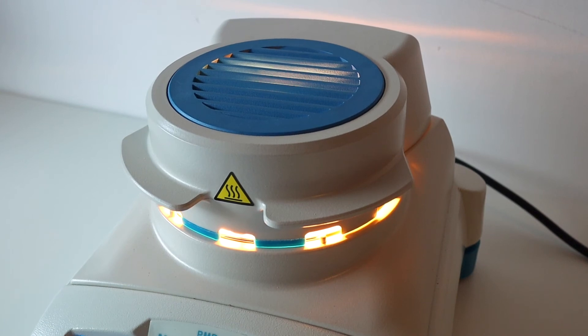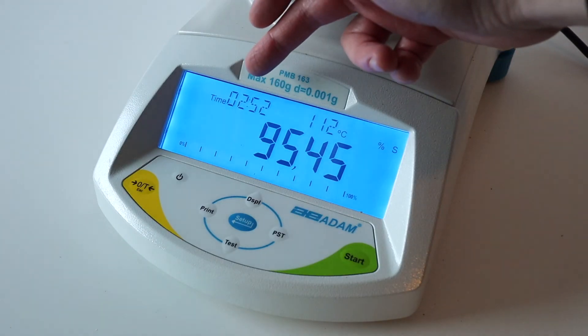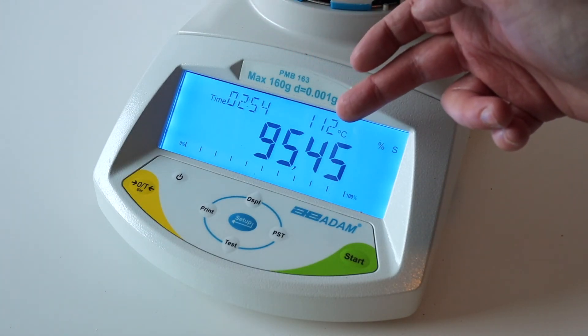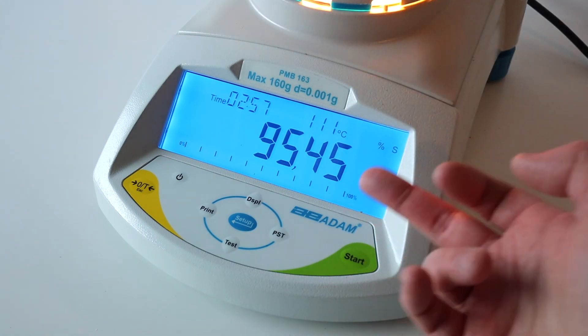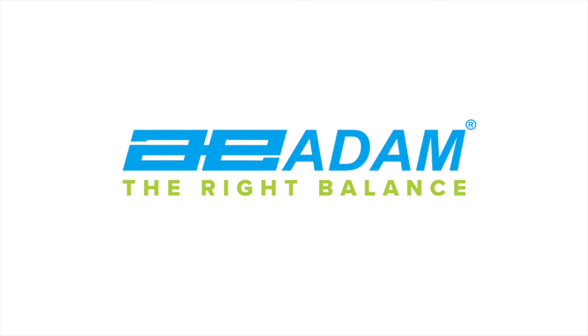The results will begin appearing on screen: the elapsed time, temperature inside the chamber, and the moisture removed from the sample. For more information about using the Adam Equipment PMB Moisture Analyzer, please see the user manual.